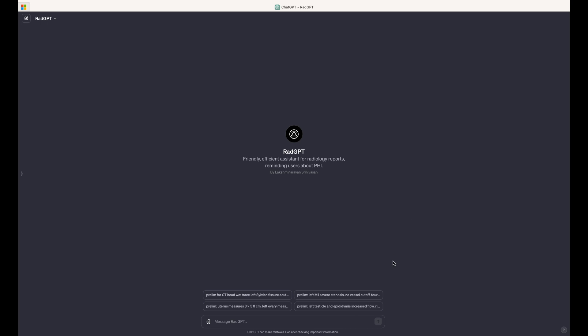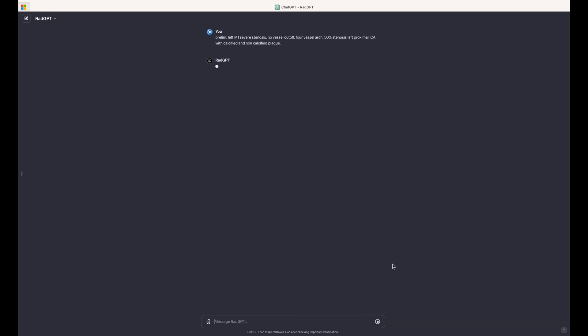So I'm going to go ahead and type in a prelim for a CTA head and neck, but I don't need to actually tell it it's a CTA head and neck. So I'll type in the word prelim and then colon, and then I'm going to enter just the pertinent positive findings and any pertinent negative findings that I want, but I don't have to be thorough. It'll fill in all the details that I didn't include. So instead of typing this out, I'm going to select one of these pre-scripted prompts right here, which you can also try out yourself.